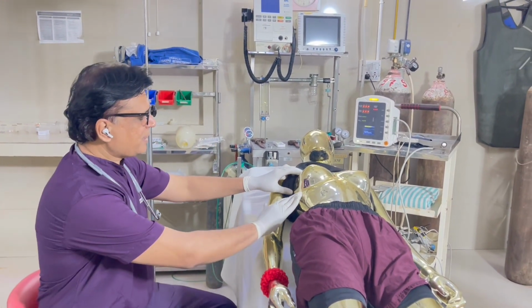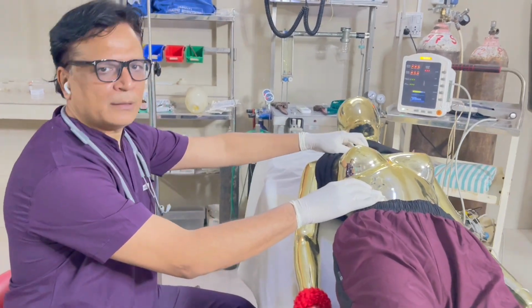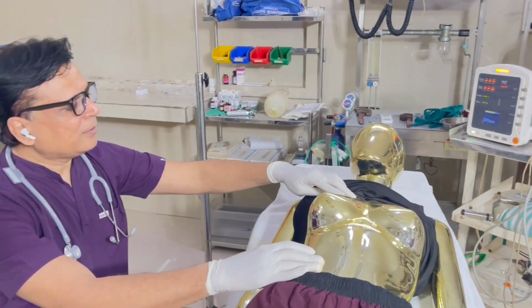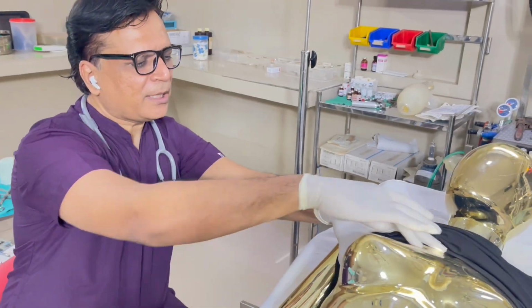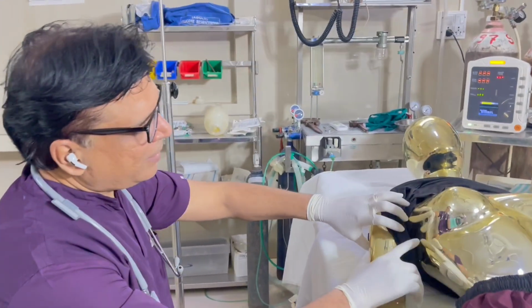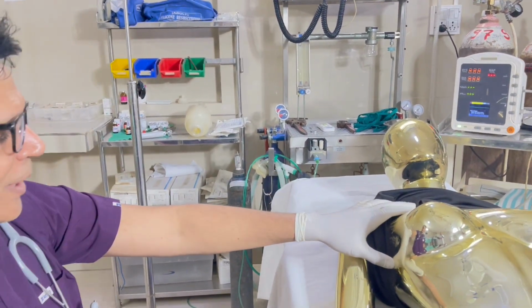And you have to count the ribs from the sternal angle. So this is the sternal angle. You have to measure from here: second, third, fourth, fifth. So here, I am starting from here and counting on the right side. This is the axilla, and this is the point where I am going to put the drain.